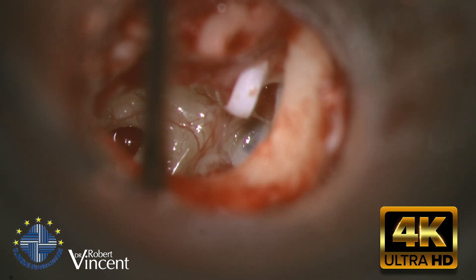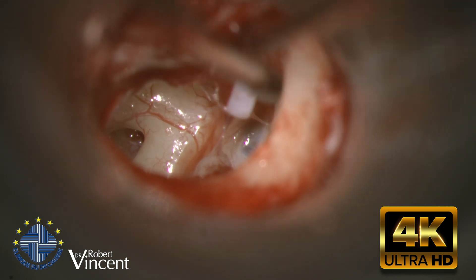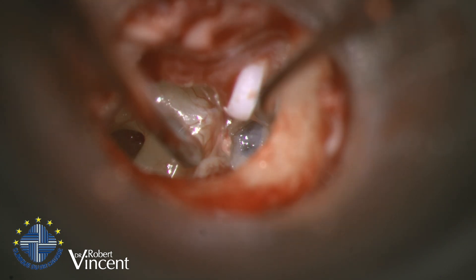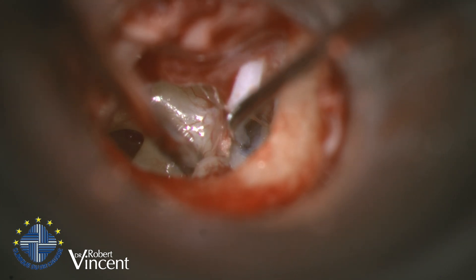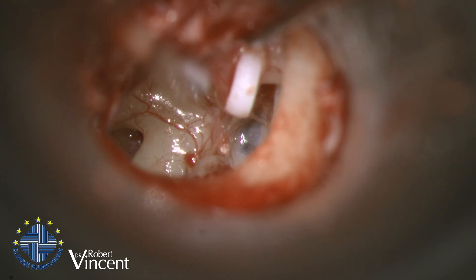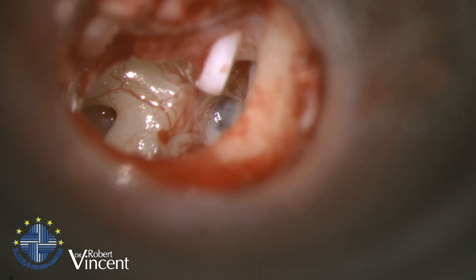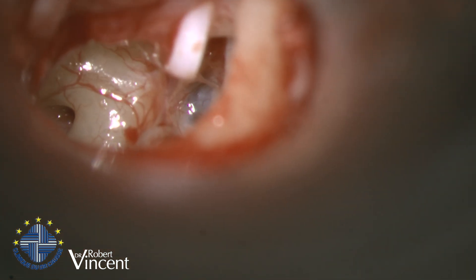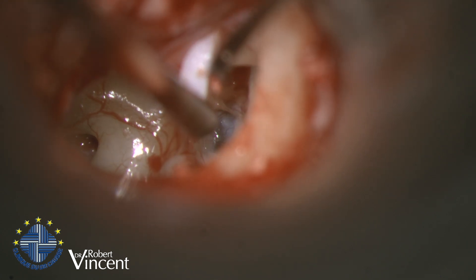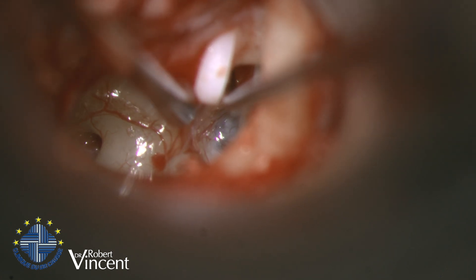Going back to the history: this patient was operated on the left ear 30 years ago, elsewhere — I think in Paris — and I don't know exactly what was done. But now we can see there was probably a total stapedectomy. We have a nice view of the oval window at 12, 3, and 6 o'clock. The piston is still attached to the incus, but there has been a migration of the distal tip of the shaft into the oval window, probably fixed to the anterior pole. You can see the shaft is very anterior.